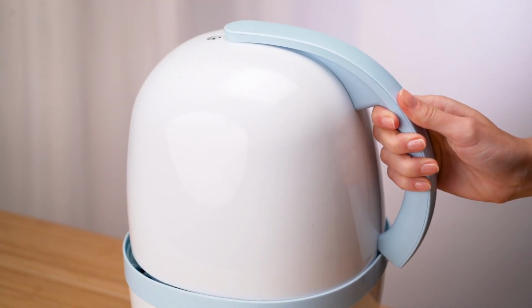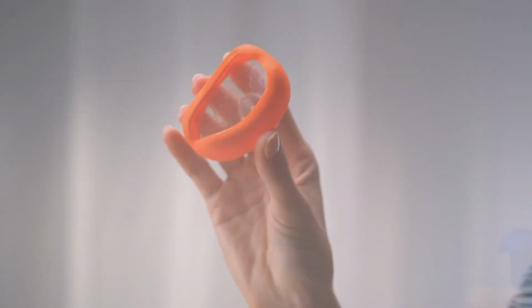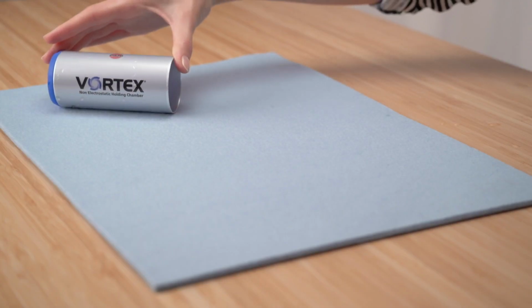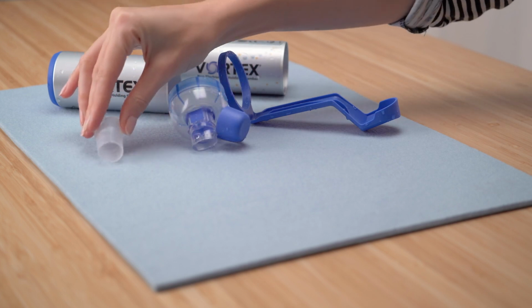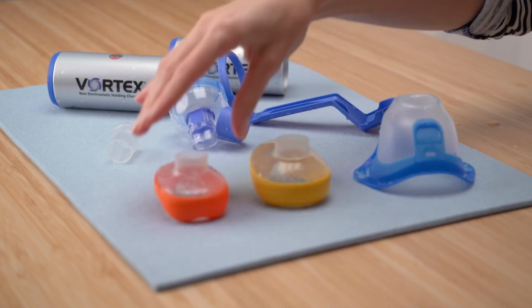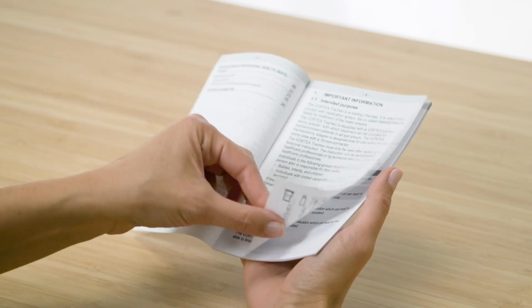Dry the individual parts directly after cleaning or disinfection. Shake out any excess moisture. Ensure that there is no residual moisture in the parts. Place all parts on a dry, clean and absorbent surface and allow them to dry and cool completely. Please always observe the instructions for use when cleaning and disinfecting the vortex.